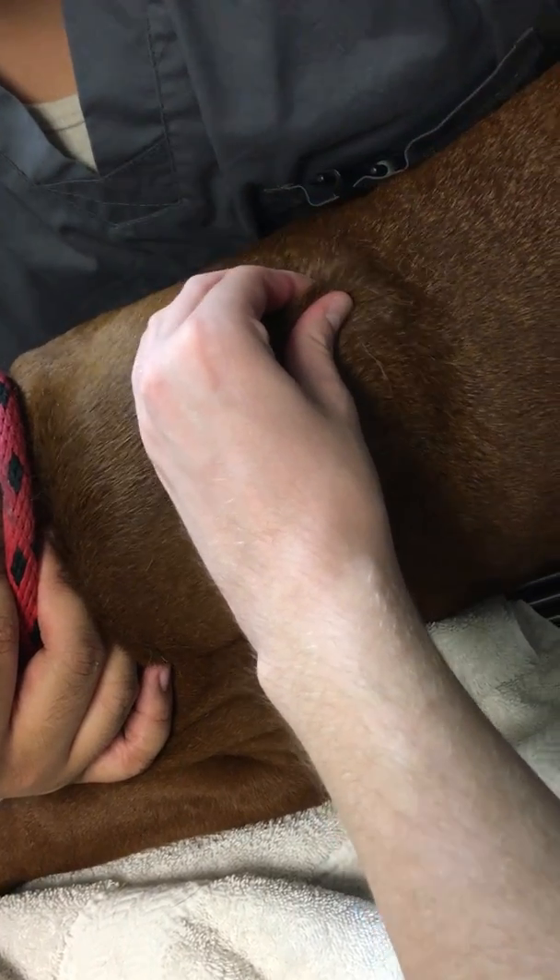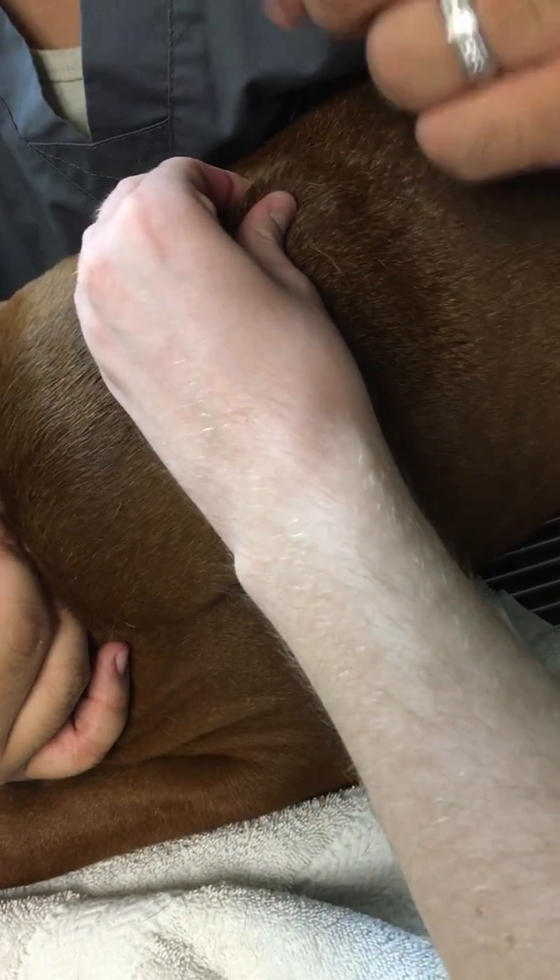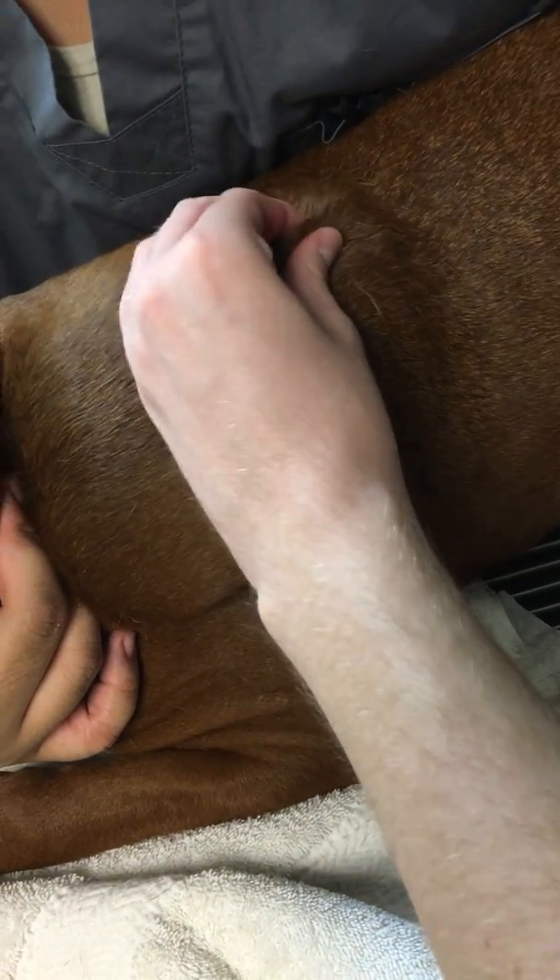And if there's blood when you pull it out, still hold it and just get some hydrogen peroxide and a cotton ball and wipe it. If there is blood, because they will bleed sometimes.